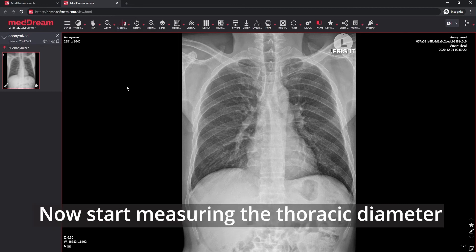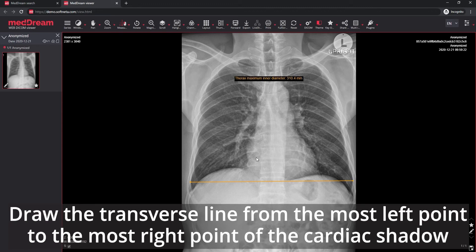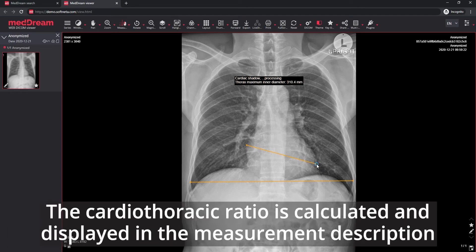Start measuring the thoracic diameter. Draw the line between the inner borders of the same rib at the widest place of the thoracic cavity. Then draw the transverse line from the most left point to the most right point of the cardiac shadow. The cardiothoracic ratio is calculated and displayed in the measurement description.